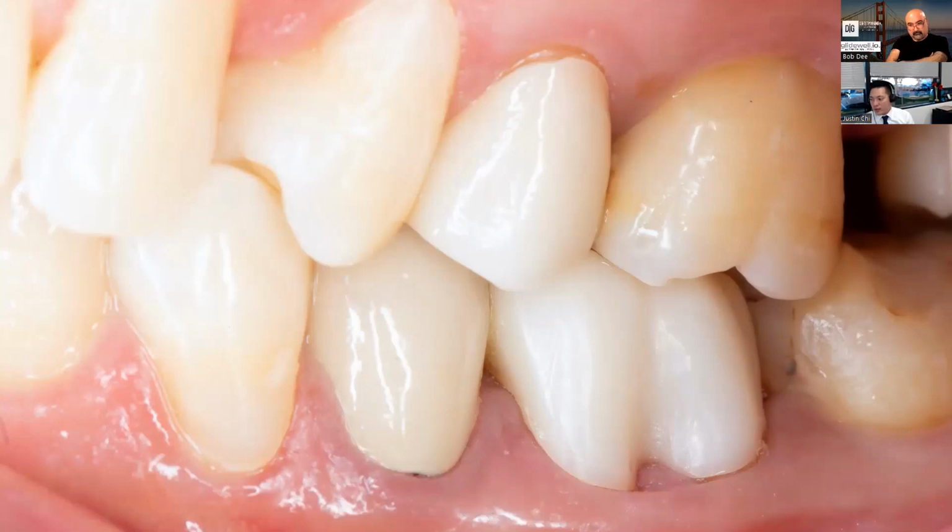So this final photo was taken about 2 weeks after the delivery, and you can see how the soft tissue filled in that furcation area. And we know that soft tissue really adapts well to zirconia, and even more so to just polished zirconia. So there's nothing on the outer surface. There's no stains, there's no glaze, there's no roughness of any kind from that characterization process that can sometimes happen even from the lab. So you have a really smooth, polished surface, which we know zirconia is highly biocompatible.